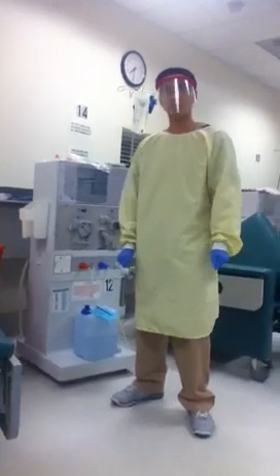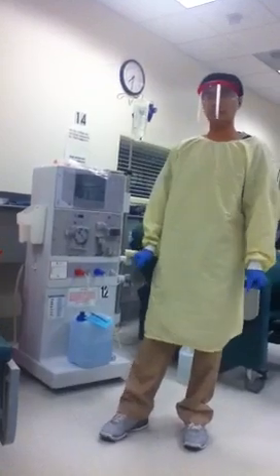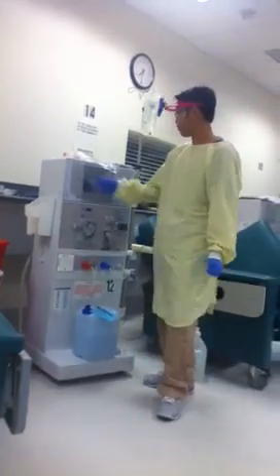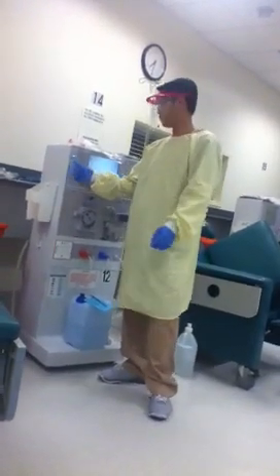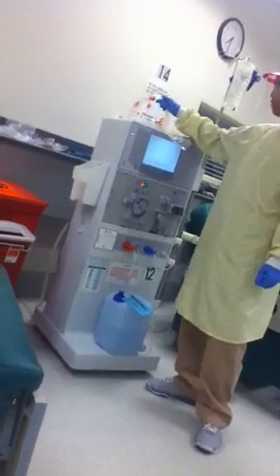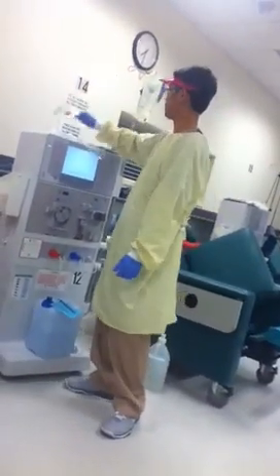Hi, I'm going to demonstrate the first part of priming dialyzer, entitled setting up the machine and the lines. So the first thing we're going to do is to turn on the power. I turn on the power now. And while waiting, I'm going to show you the equipment that we're going to use.